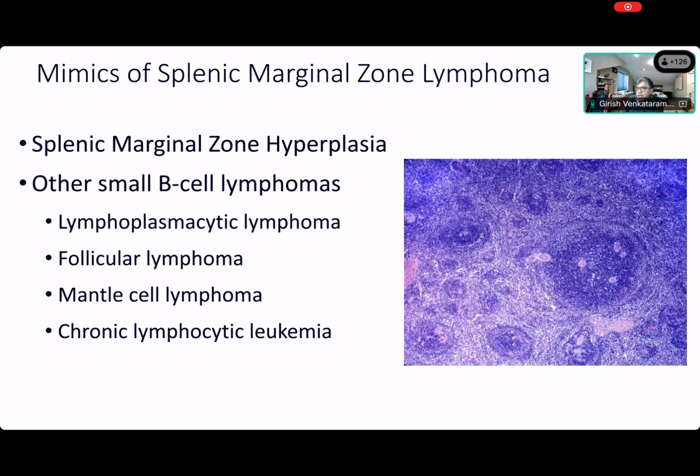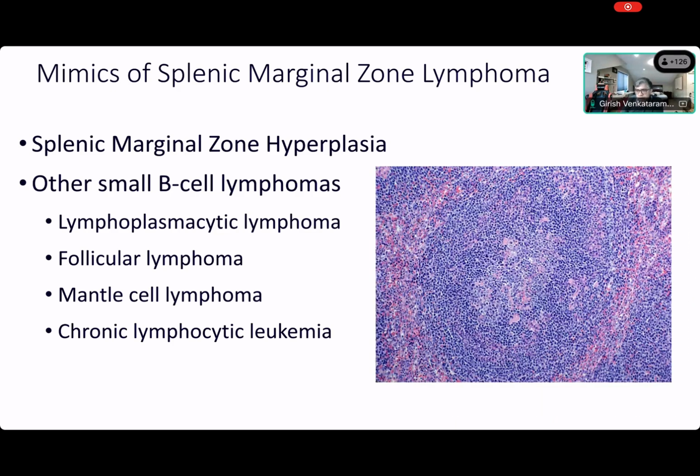This is one more here, and this is one more here. So obviously, looking at these pictures, they all look the same. You'll never be able to get to a diagnosis. You'll need a combination of stains and history to get a diagnosis.